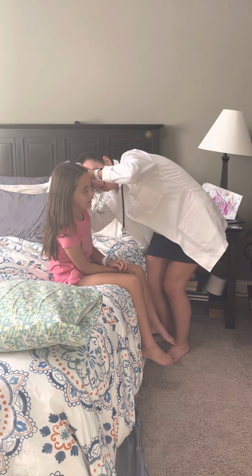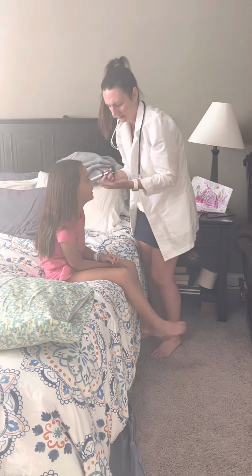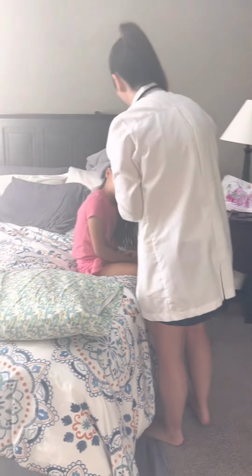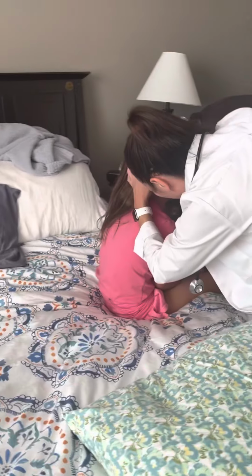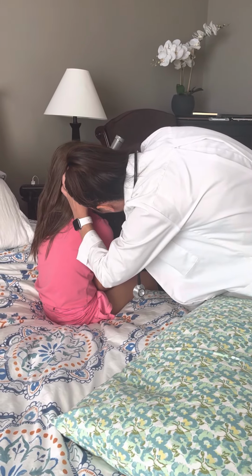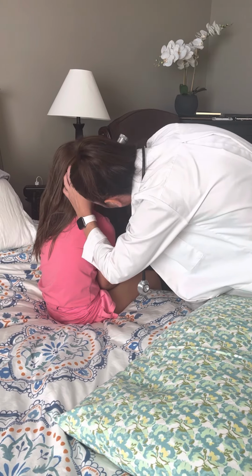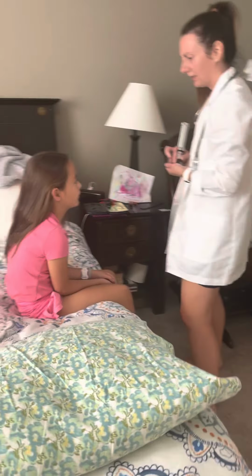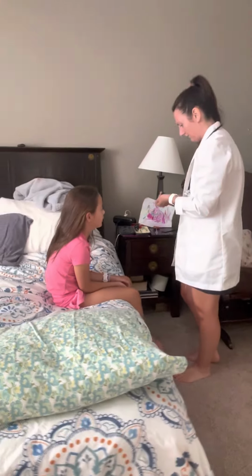And I look at the tympanic membrane, make sure everything is okay. And then I'd go to this side, and again, look in her ear, pull on her ear a little bit, and straighten out the ear canal, and make sure that the tympanic membrane looks okay, and everything else.